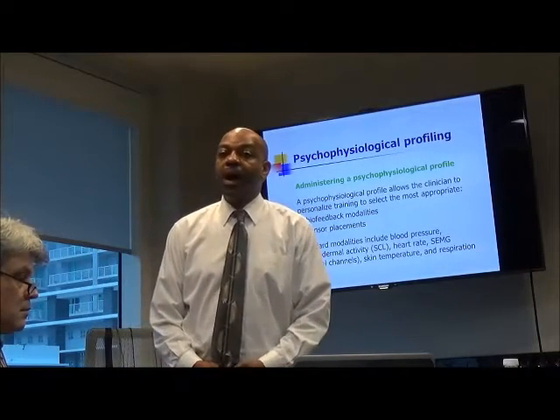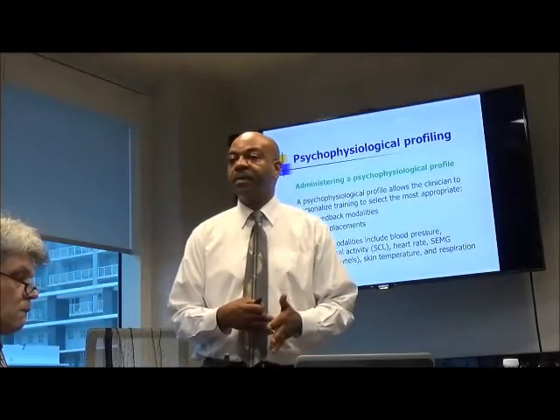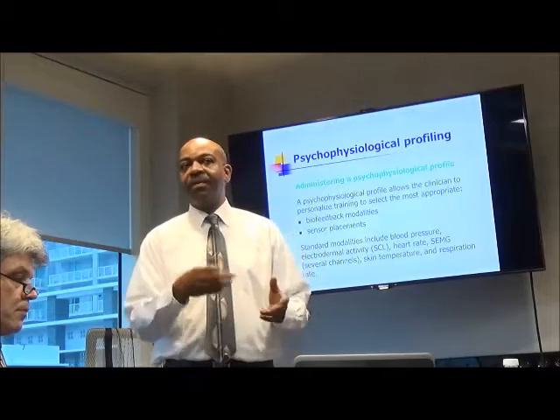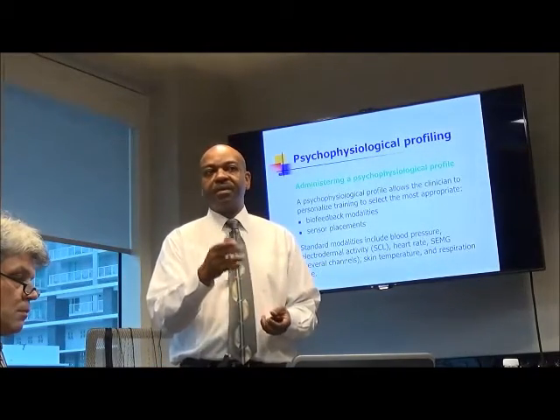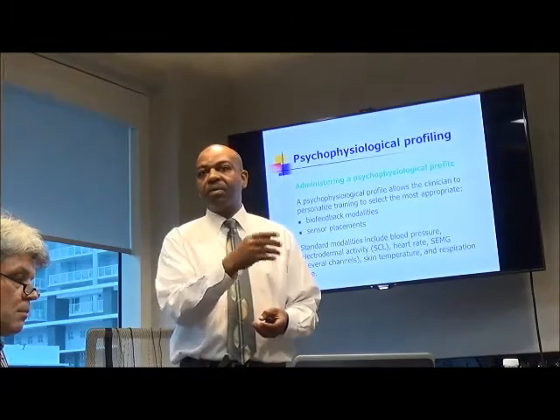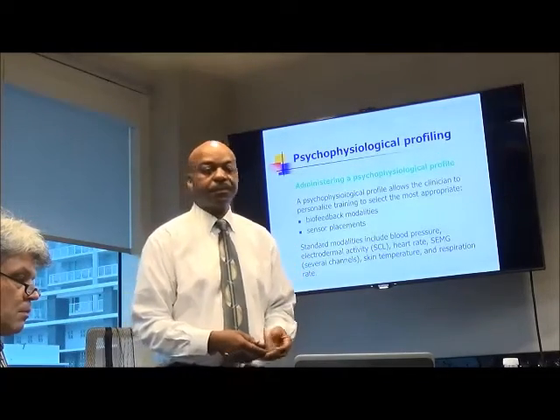Now the blood pressure, I haven't seen that. How do you? I can show you, I have a blood pressure unit with me, but it plugs into a USB port. Okay. And I'm not sure what version of the software you have. If you don't have the newer version, you might need to update your software. But what happens is it plugs in through a separate USB, and you can trigger it manually to inflate and take a blood pressure reading, or you can have it programmed where every certain amount of time it inflates and deflates and gives you a new reading.